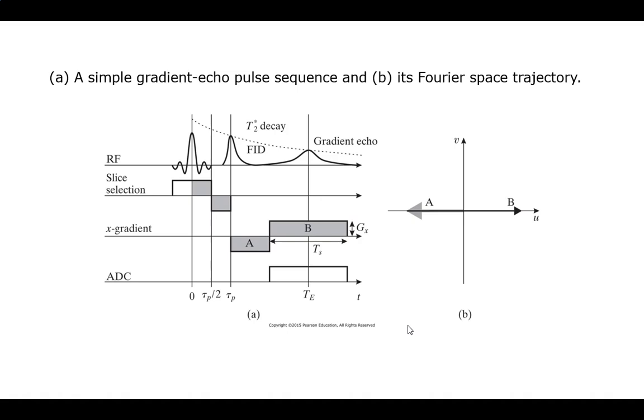So when I now impose this, it's going to reverse the directions and they'll start spinning up, and therefore I'm starting from the negative side and going all the way down. So again, we've ignored Y. But by doing the initial first pulse here, it allows me to kick all the way to the negative direction.